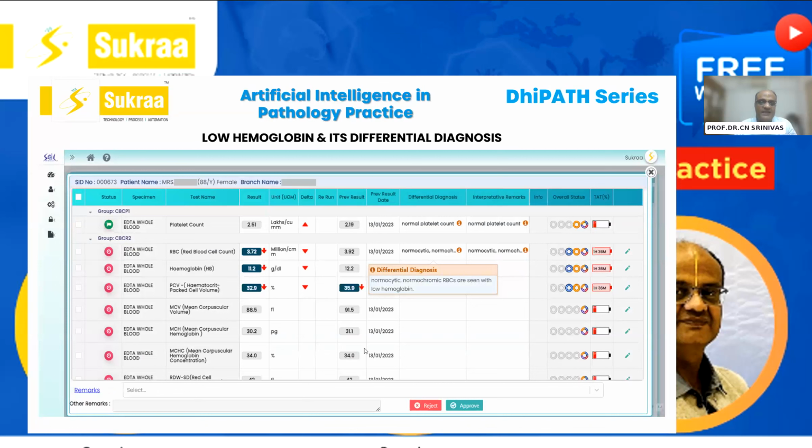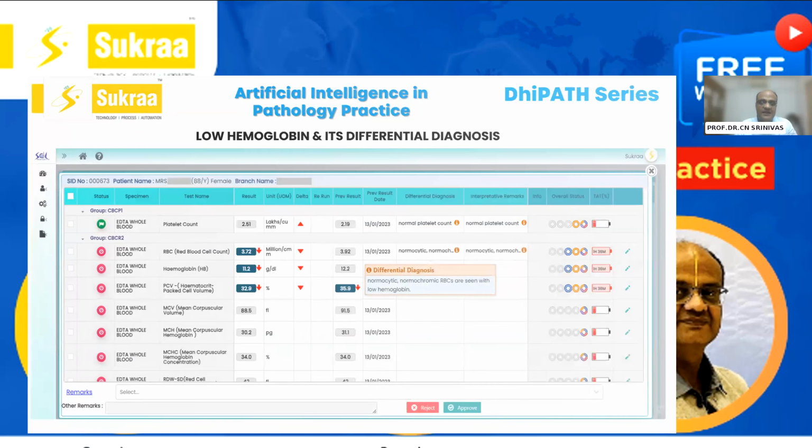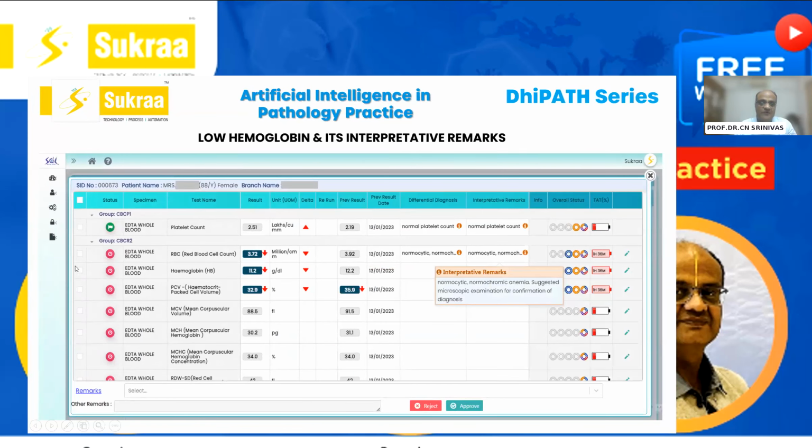You have one more case with a low hemoglobin, 11.2. RBC is low, PCV is also low, the indices are there, and you have normochromic normocytic RBCs with the low hemoglobin. Anyone can guess that it could be a normocytic normochromic anemia, where you can have interpretation with the clinical chemistry parameters also.